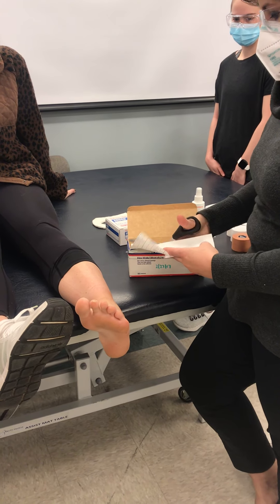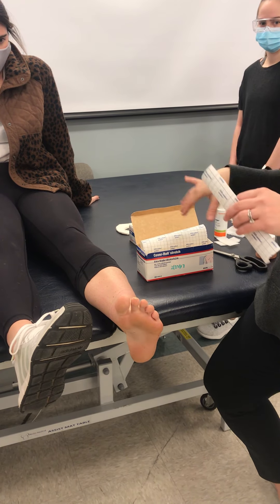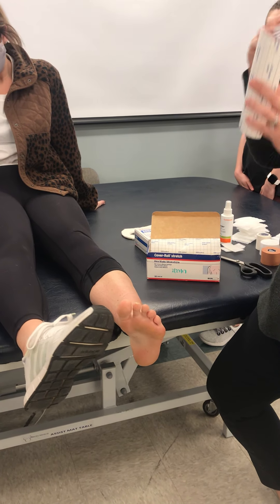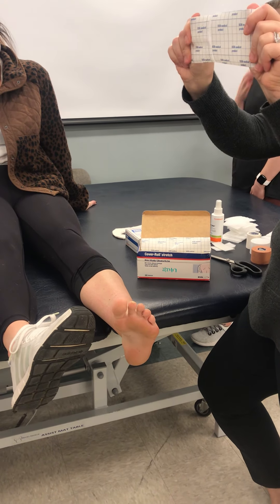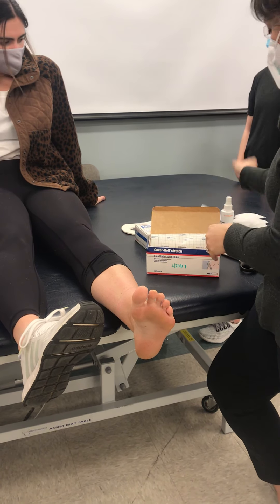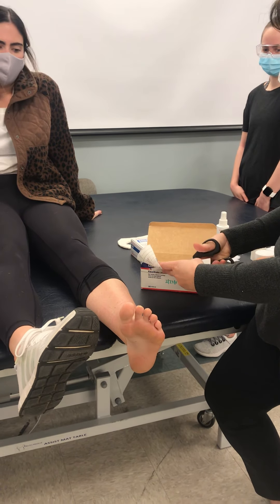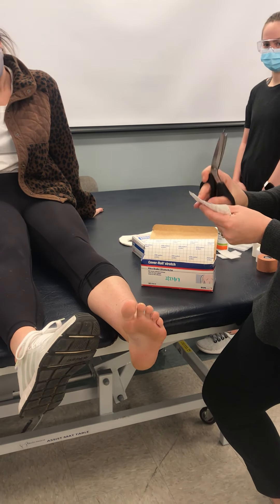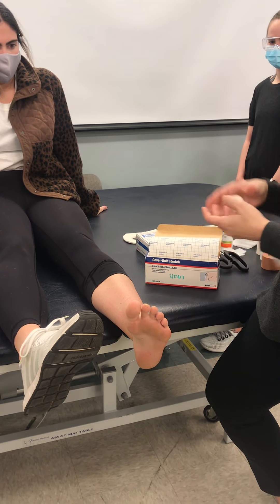This cover will stretch — you'll see the box that says 'stretch.' It's going to be kind of forgiving when you're working on the foot, so that when we get around those little angles of the arch it'll be easier. I'm going to go ahead and clip off around my edges so that doesn't get stuck on any socks.